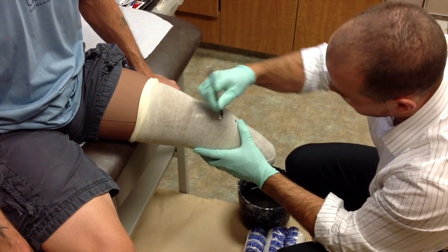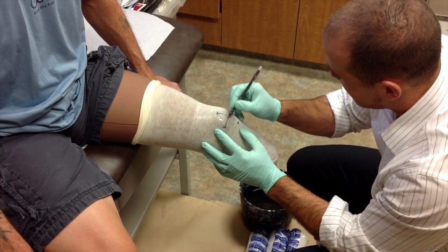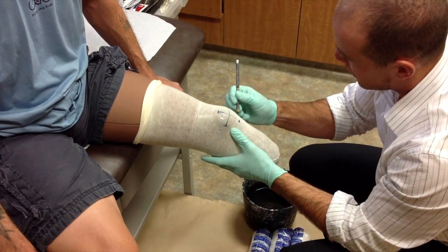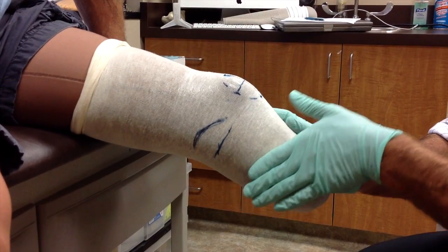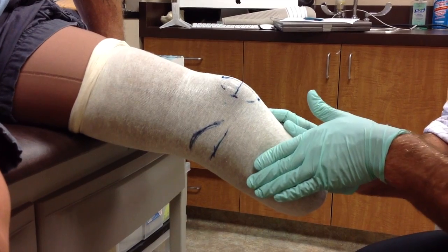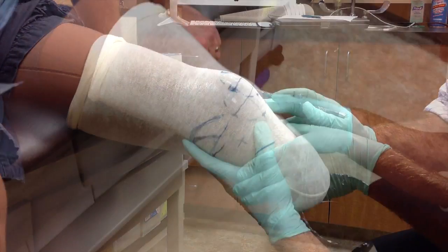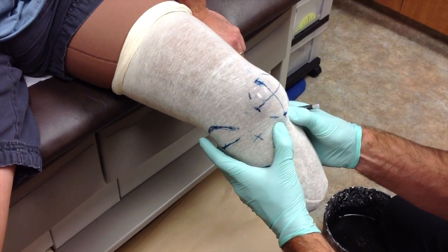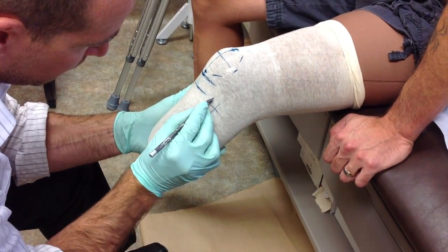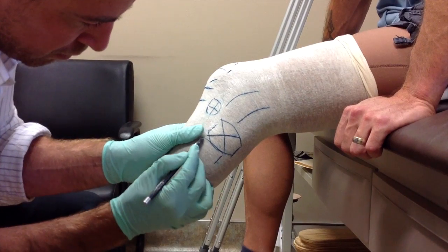At this point, the practitioner will use what's called an indelible pencil to mark certain bony landmarks of your limb and also mark certain areas that contain soft tissue. These are areas that the practitioner is going to pay special attention to while building your check socket, so they'll definitely take their time marking every little detail. Some practitioners mark a lot; some practitioners don't mark much at all.